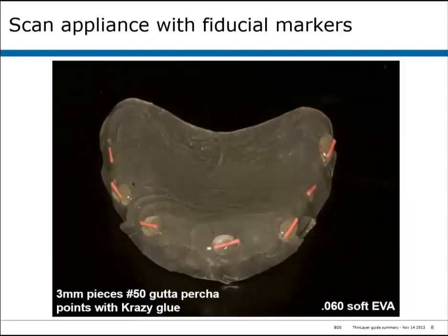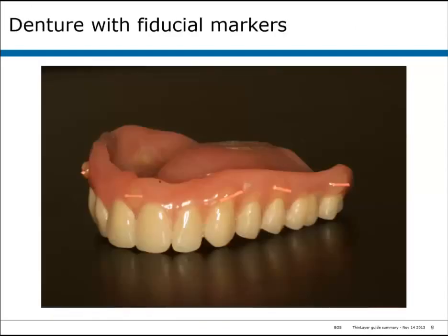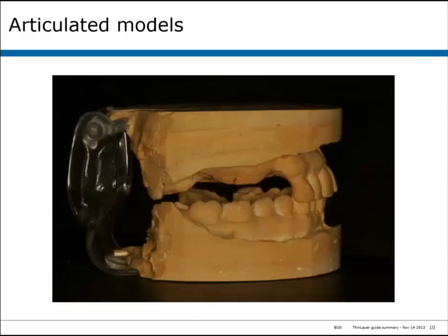For edentulous cases, an appliance can be made in much the same fashion. If the denture fits reasonably well, we can do the dual scan method whereby the fiducial markers are placed on the denture itself with triad or with the adhesive glass bead markers.